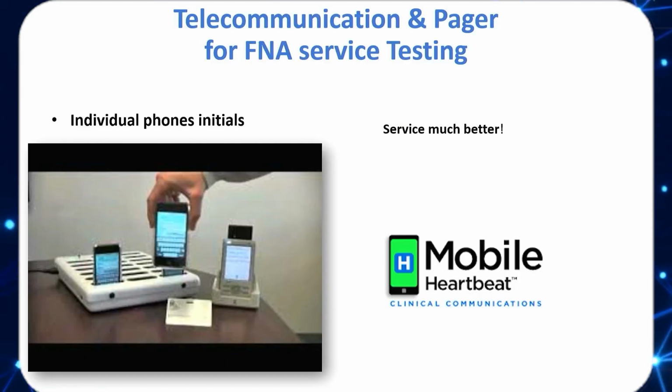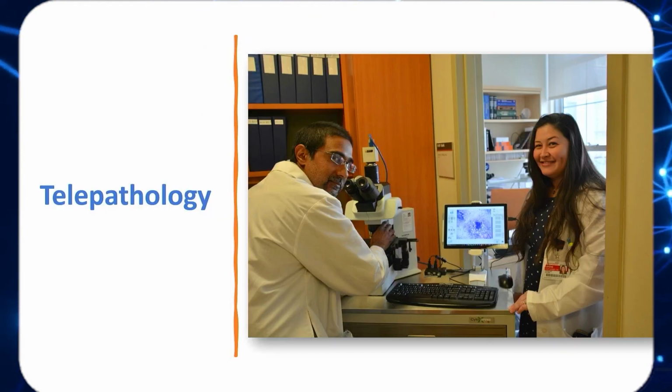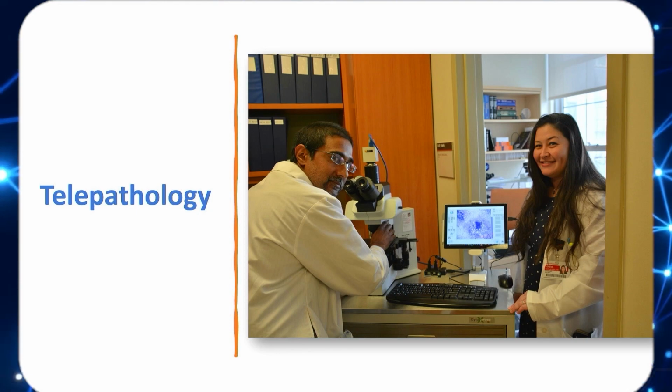But how do I get involved in it? There is an individual mobile phone that the cytotechnologist has with them, and they can call me, and then I can be physically present on my scope and look at these cases away from the site. So again, there might be 3 procedures going on, but through the web-based system that we have, that same image can be downloaded to my desktop, and I can give an adequacy assessment in real time for that procedure. So that has been the standard of care for at least 8 to 10 years in our practice. This has really been quite successful in implementing and getting a good sample up front.